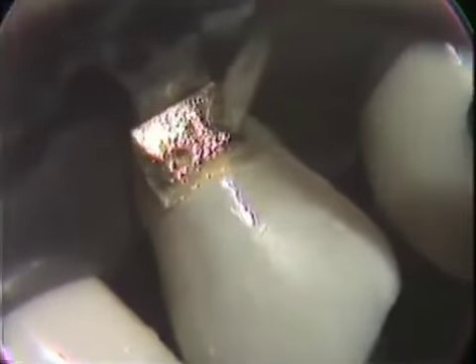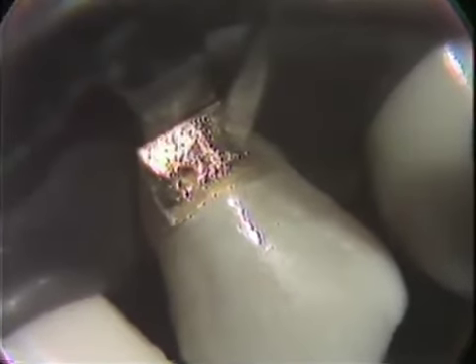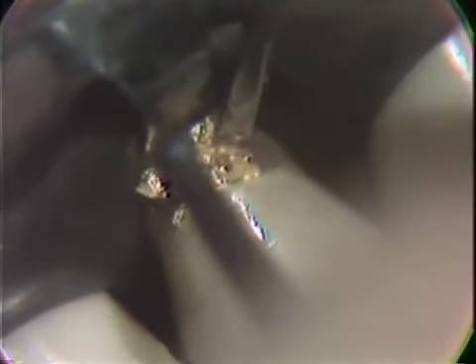Placing this into position and using the 13 and the 14 condensing instruments, one to hold in this case and the other to now lay this against the axial wall portion, getting it into position first, and then begin condensation starting in the central area and working that material overlapping in the central area, working first towards the cervical margin.